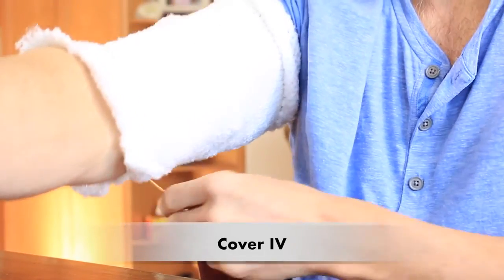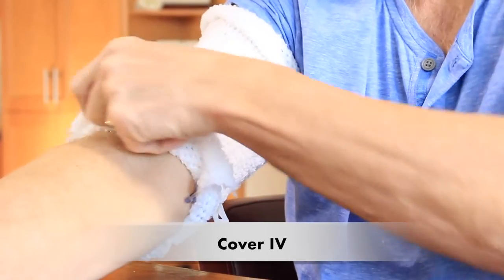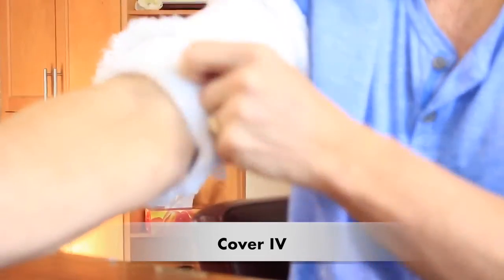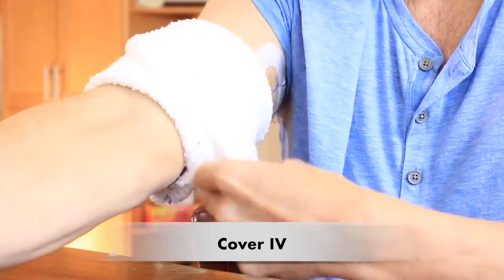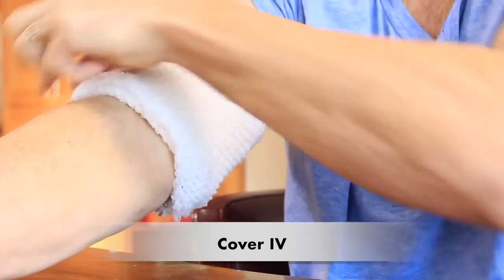And then if you have a long extension set, you can loosely wrap it around your arm, but you have to be very careful that it is not tight or it can cause damage. So if you're doing that, just wrap it around really loosely. So he's covering up that extension set. And then he's just going to fold it down to cover everything up, and he's going to pull it up so that it covers his IV bandage.